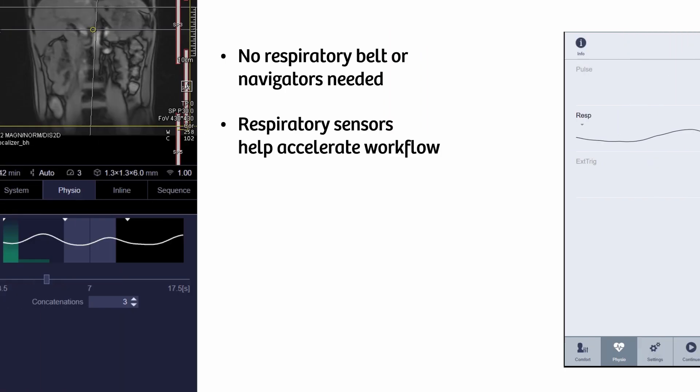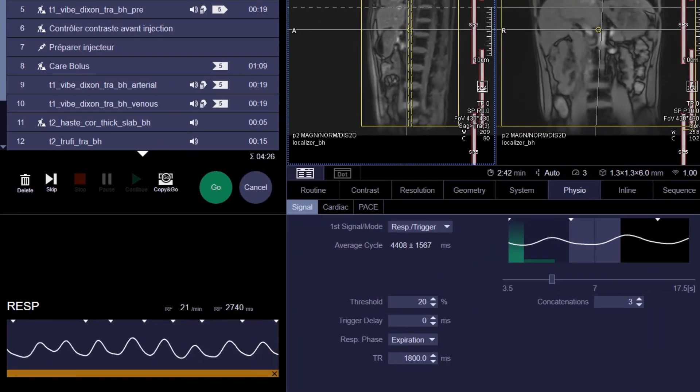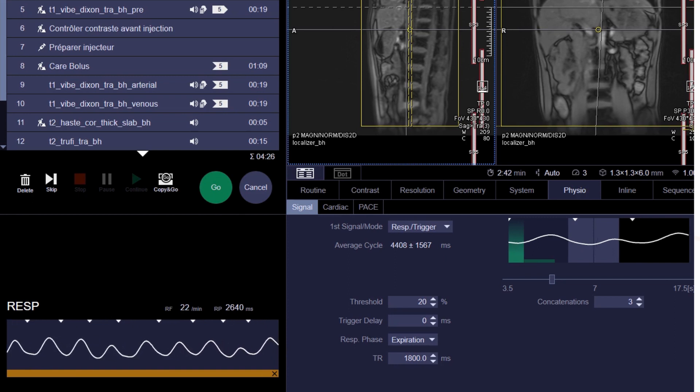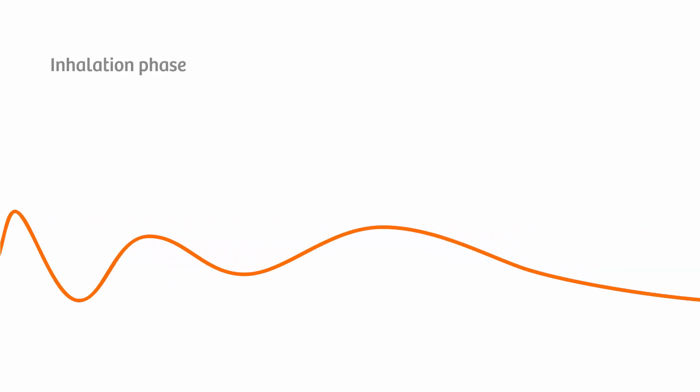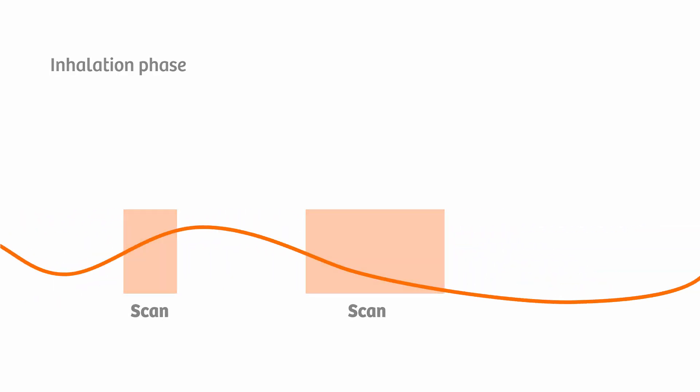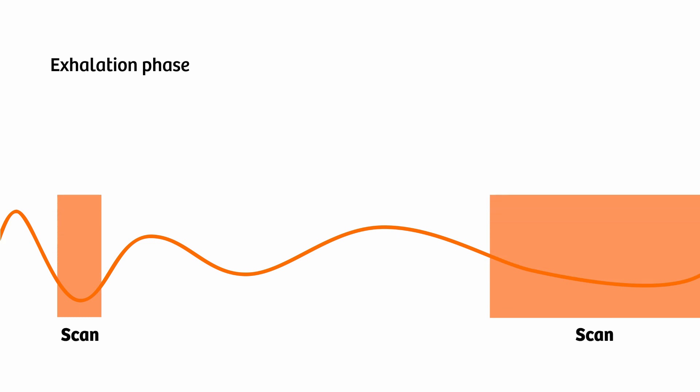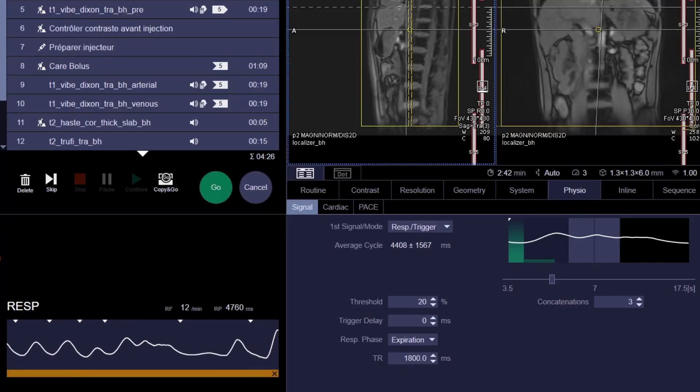The console provides visual feedback of the patient's respiration during the entire examination. For respiratory triggering, simply choose the desired scan phase such as the inhalation phase or the exhalation phase, and sequence triggering is done with no additional effort.